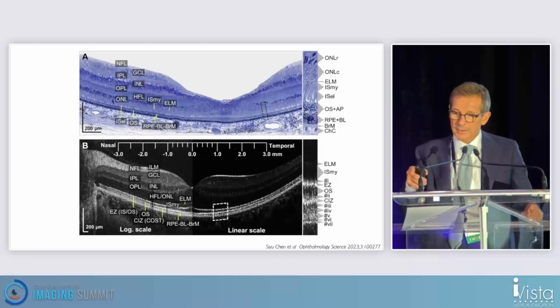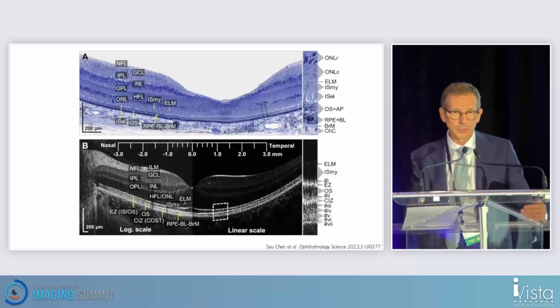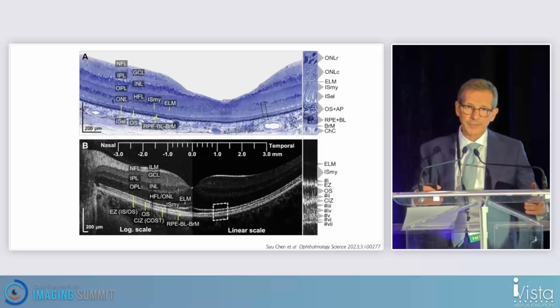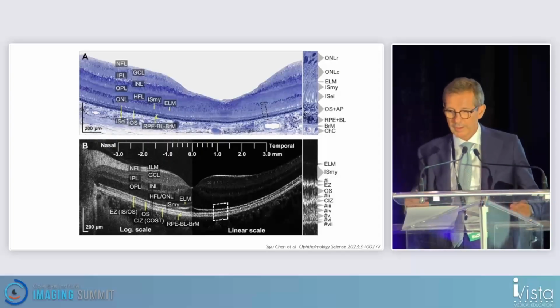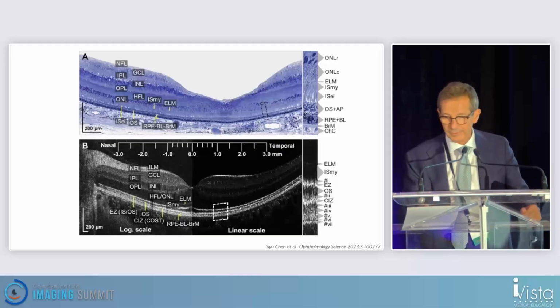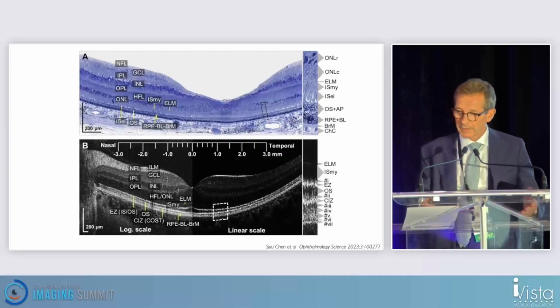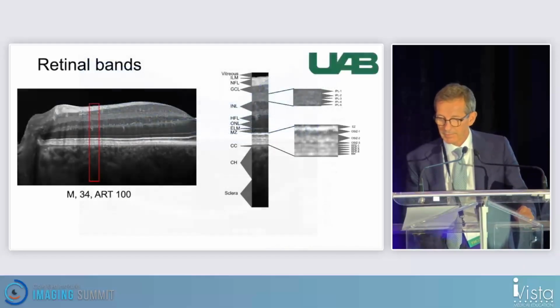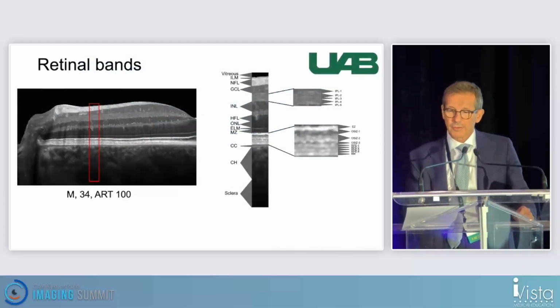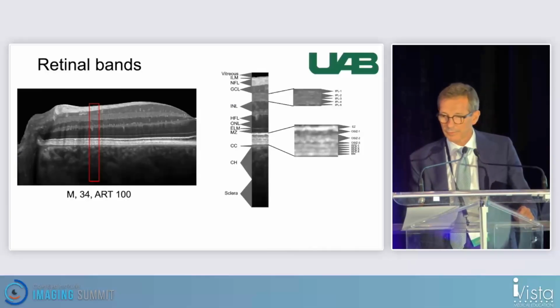I want to underline two things in these images. Usually we use a log scale that allows us to have more defined images, more contrast, but if we want to measure, we have to use the linear scale, and unfortunately we don't have that in our commercially available devices.